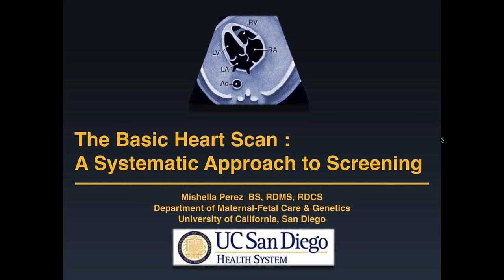Any other questions? Oh, here, there's more. Yes, I didn't see it. I'm so sorry. Is it mandatory to 3D scan? It is not mandatory, but studies have shown that it is very helpful to include as part of your scan.